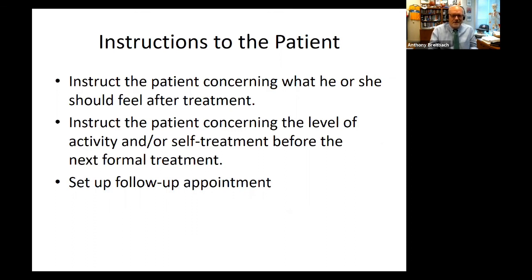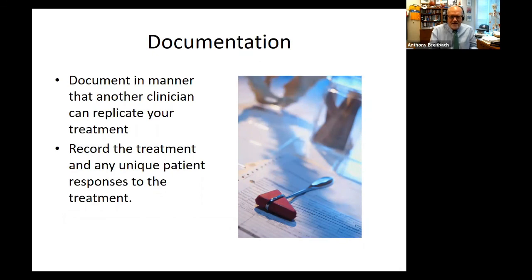Very few times is someone getting treated in isolation, right, with a single treatment. Usually they'll be part of a treatment plan of some sort. Okay. You also want to do any post-assessment in these situations. You want to document in a manner that another clinician can replicate your treatment. So you need to make sure you write the parameters down, the intensity, the duration of the treatment, their setup, how they were positioned. All of those types of things need to be documented so that somebody who picks up your chart or looks at the electronic health record can replicate the treatment. And you want to record your post-treatment assessment. So if you tested pain before, you want to test pain after. You want to really determine the efficacy of your treatment. You just don't want to be doing it to do it.